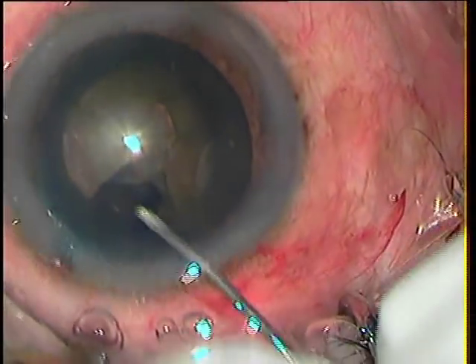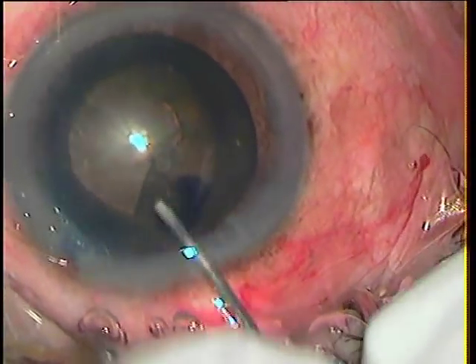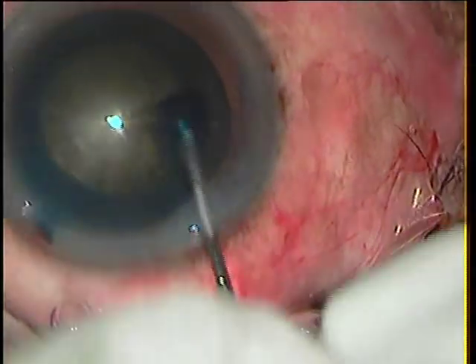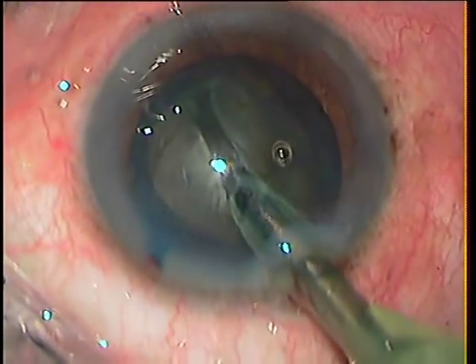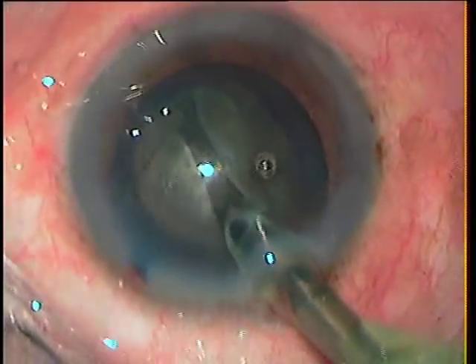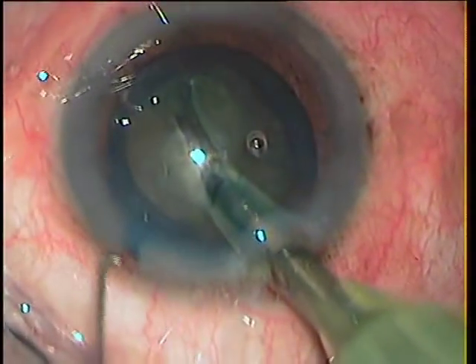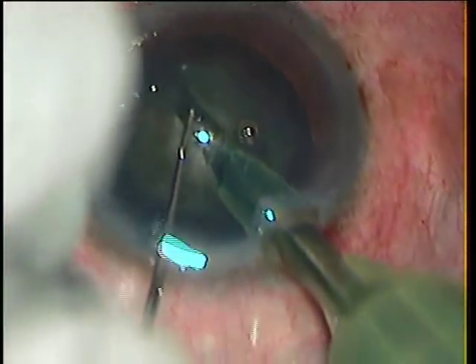I will not be showing you the whole of this surgery — I won't bore you with those details. But I just want to emphasize that it is never too late to learn. I did learn a few tricks which I tried on this case and could manage with a good result.